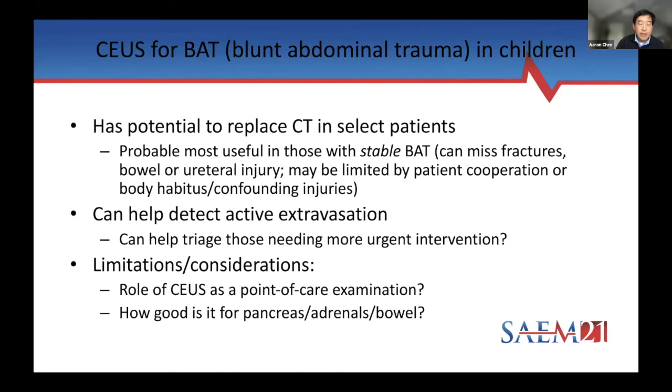But this is for those kids where we really struggle in the ED, like whether this is a kid that we want to do a CT on. If I had an exam like this, I think we would very easily do it. Even though most of those kids do fine, even with injuries, it's something you do want to know about, and it can give some better guidance for return to sports recommendations, et cetera. And then I think there will be some more work done, like can this help triage and look for active extravasation for those that might need more urgent intervention.